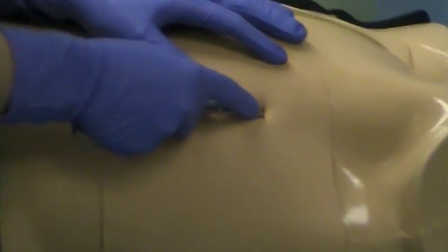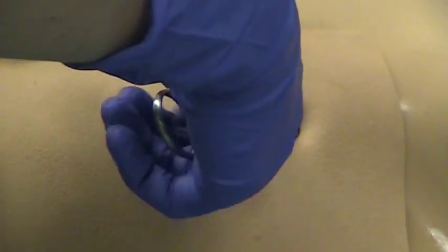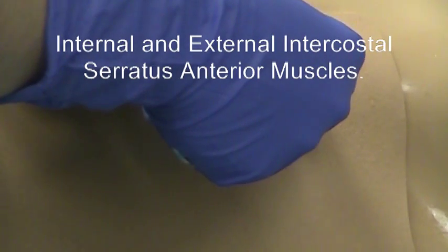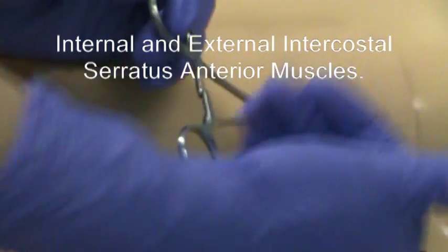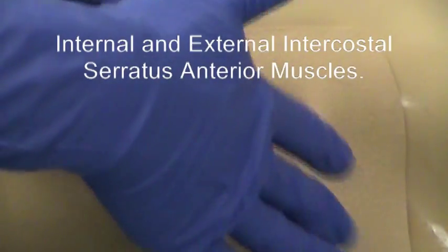So in, feel the rib, go up and over, and it does take some force to push through the chest wall. There's a lot of musculature there, and they're very strong muscles obviously because they help us breathe. Now once you feel yourself pop through, oftentimes you'll get a rush of air or fluid depending upon what your patient's particular disease process is.